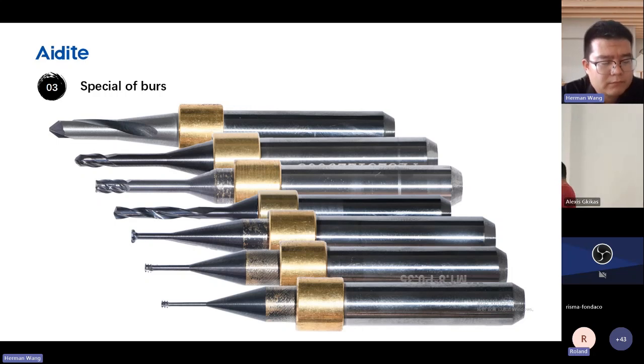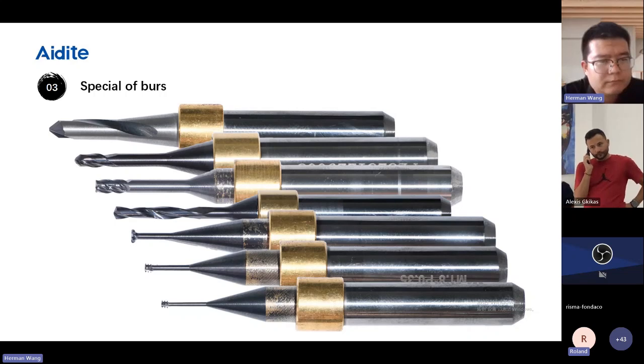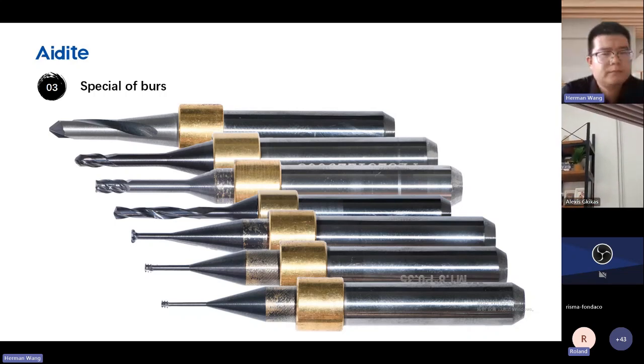Okay, so this machine has the versatility to mill PMMA, titanium, and of course other dry milling as well for zirconia, but it needs a different burr kit.